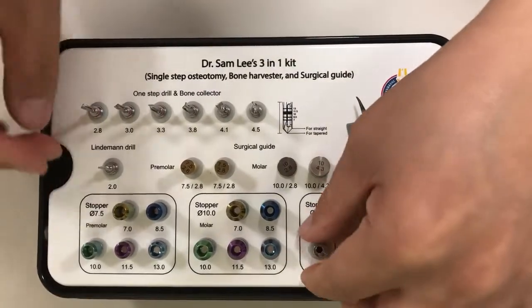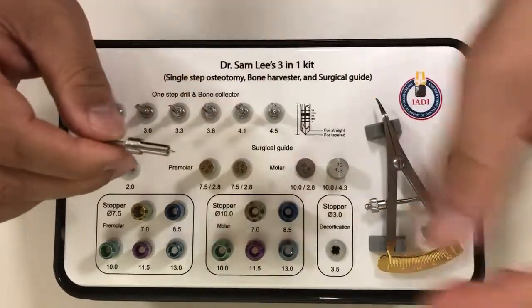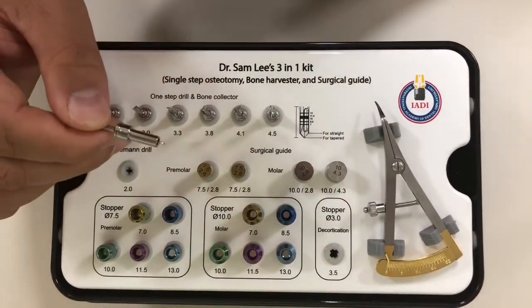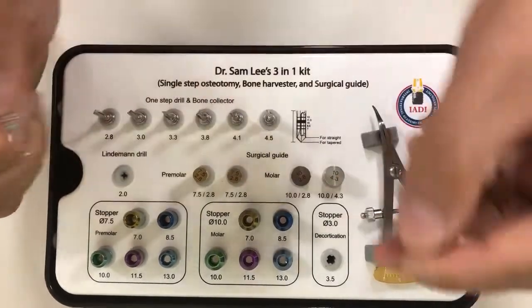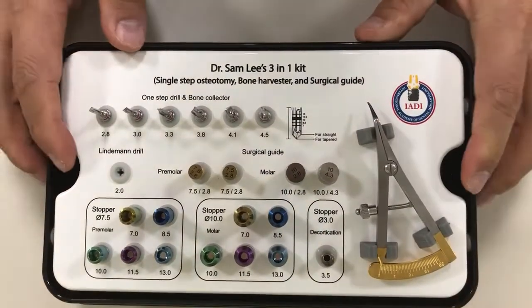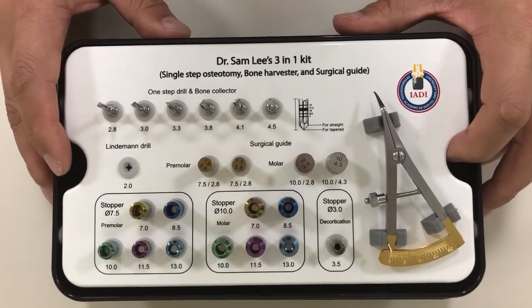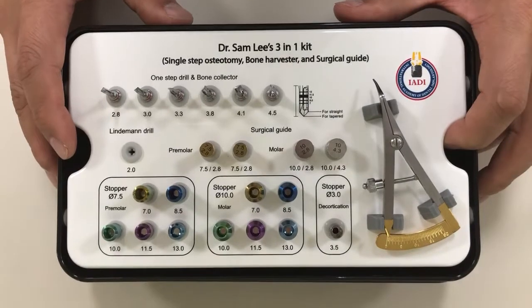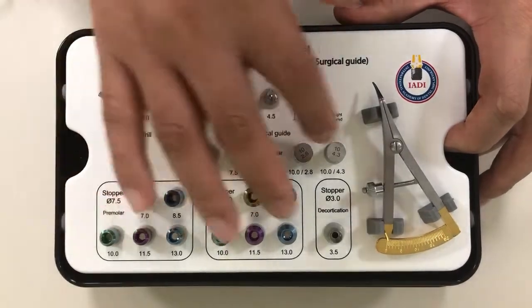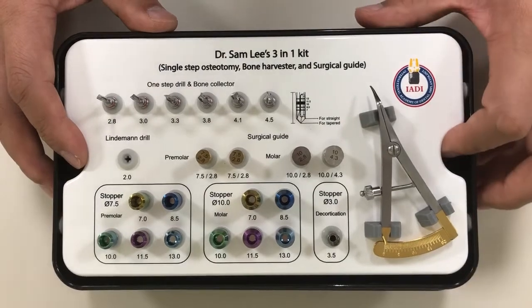If you want to do GBR and collect bone, this is a very nice way to make decortication so that we can collect the bone at the same time. Thank you very much — I hope you enjoy my new 2.0 3-in-1 kit, which collects bone, makes a single-step osteotomy, and helps you position your implant exactly on the center of your clinical crown.